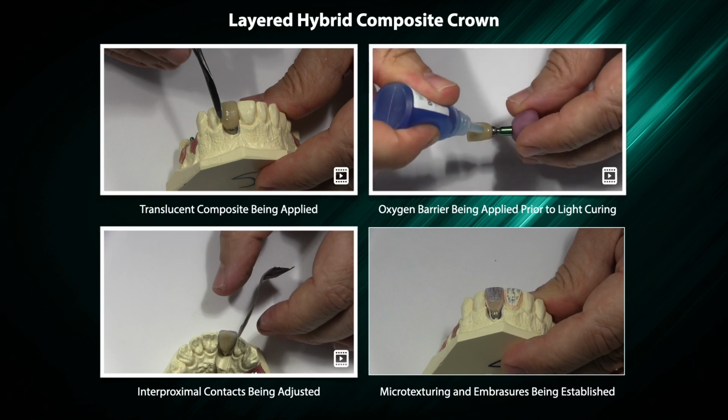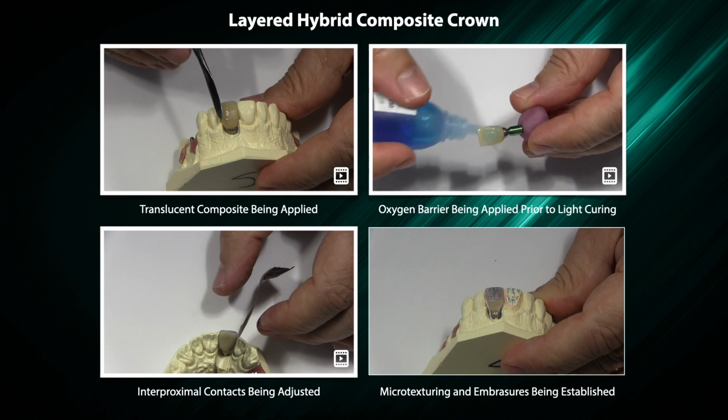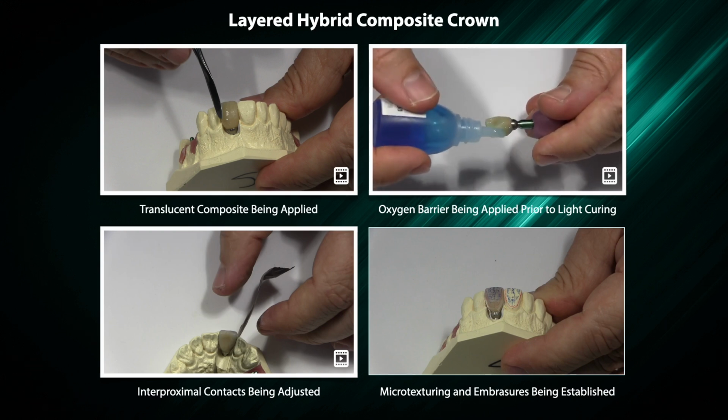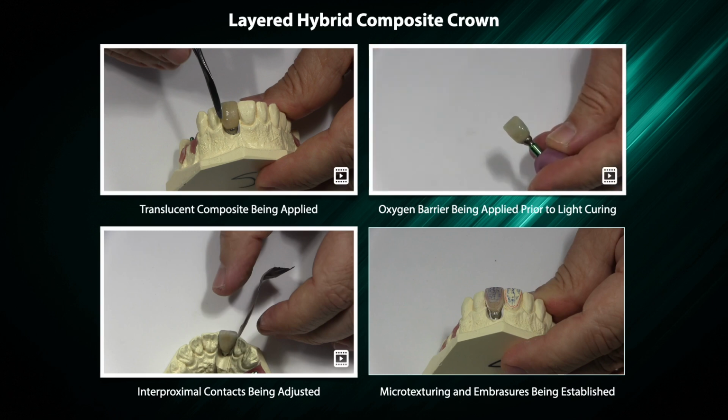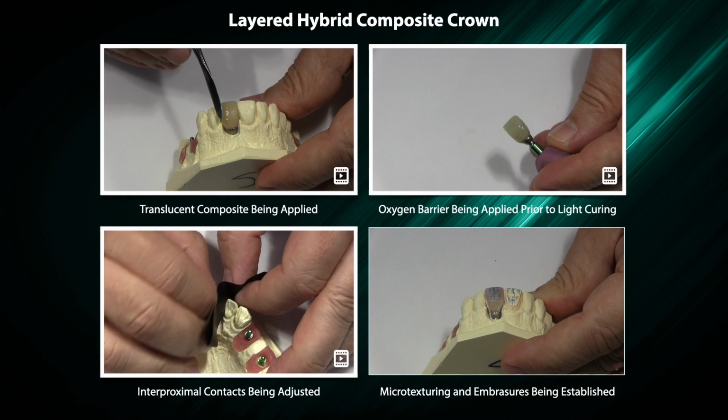Oxygen barrier being applied prior to light curing. Interproximal contacts being adjusted.